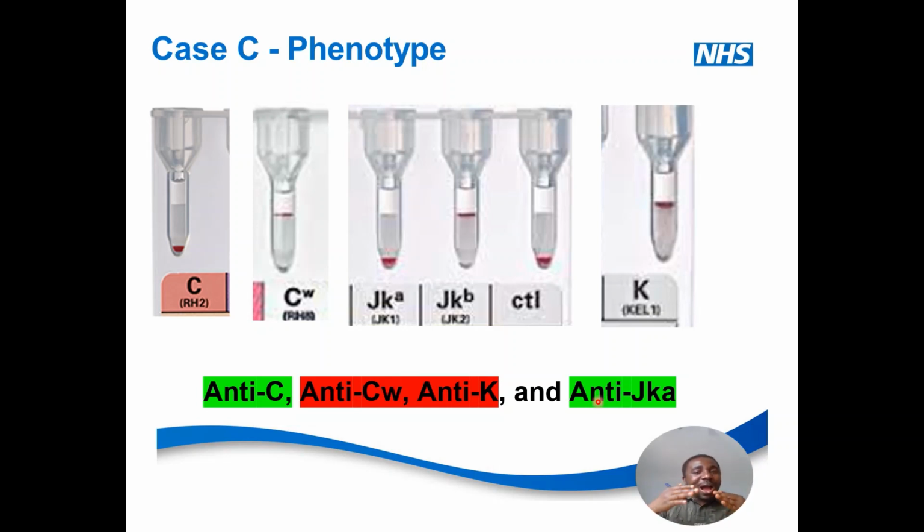So you see the way I'm taking it now. When it becomes difficult to exclude, you have tried the matching method, you have tried the cancellation method, homozygous or heterozygous, and there's still an antibody that you are not able to exclude, you do phenotype. Phenotype will then help you to confirm whether it's going to be that antibody or not. So that is what I've done here. Okay.